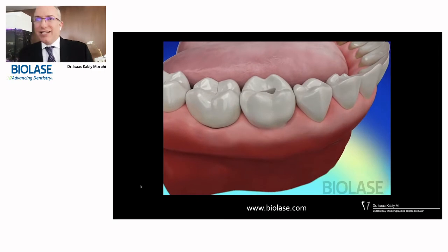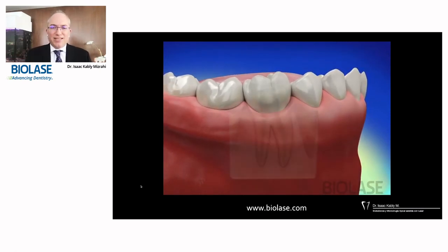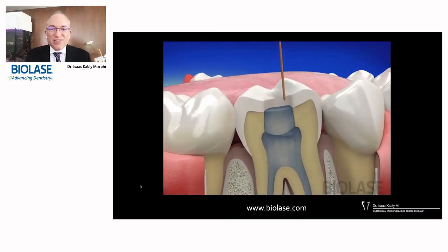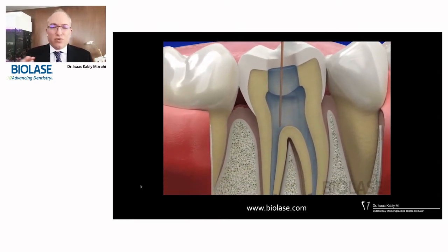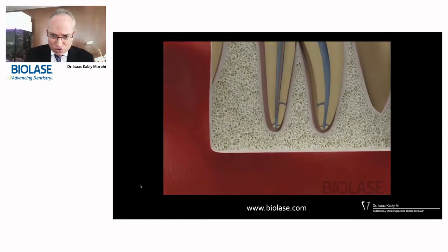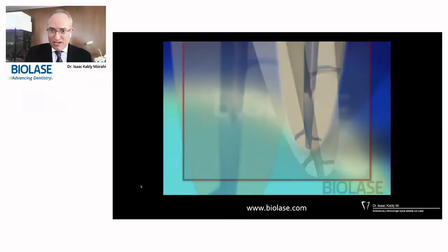This short Biolase animation shows a very close approach of what I mean. You can see in this short video how you already opened your access in the proper way, and you already instrumented the root canal, and now it's filled with water, no other irrigant but water. And then we go with the radial firing tip, which is my next topic. In this animation they don't go to the working length, they go like a millimeter short or so, and I would recommend going to the working length in order to achieve all the capabilities.